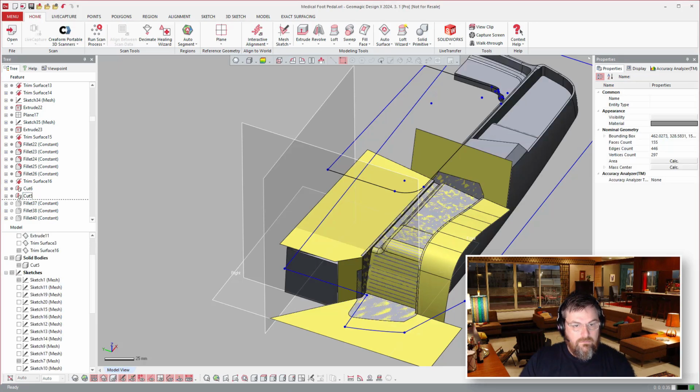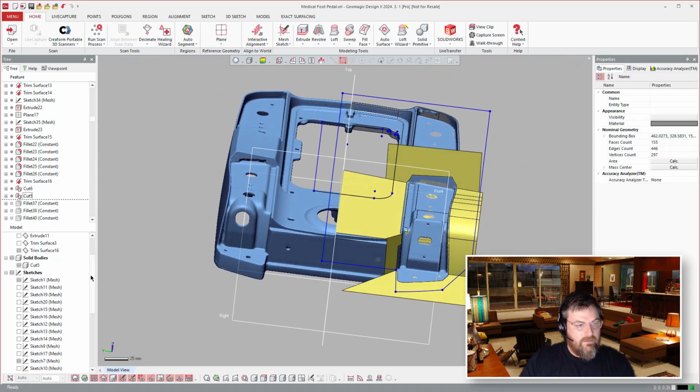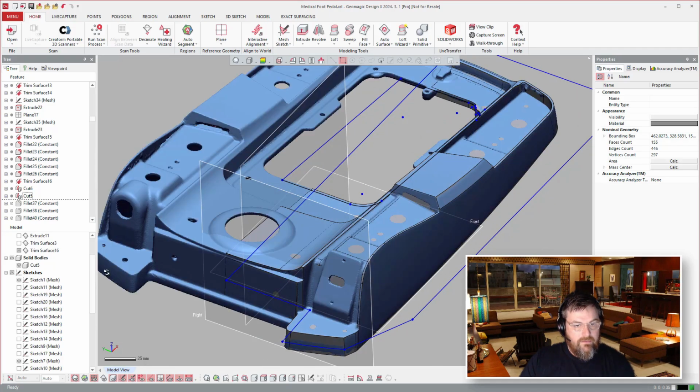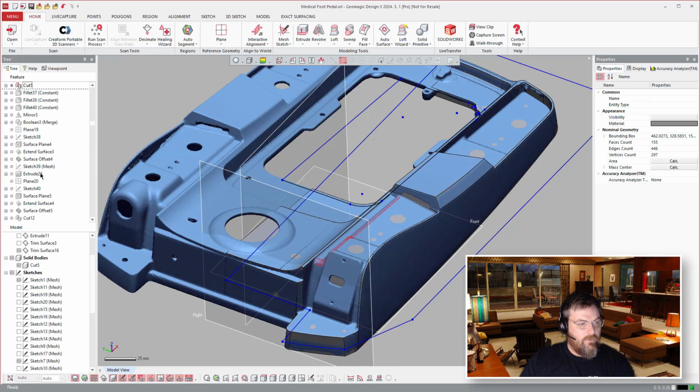Now, turn on the mesh. You see there where we're at. And hide the mesh real quick to see where we're at. So now we'll just kind of zoom forward a few more, because now it's kind of rinse and repeat.